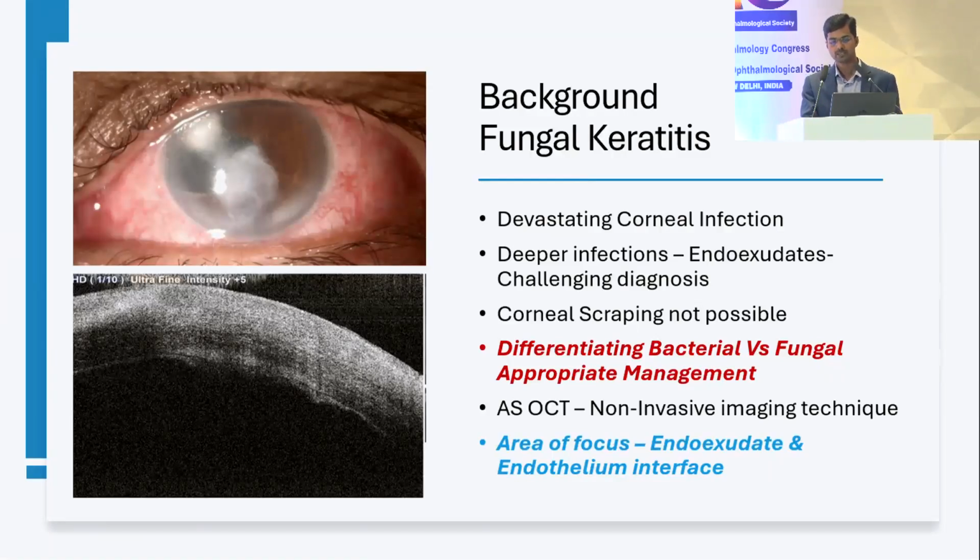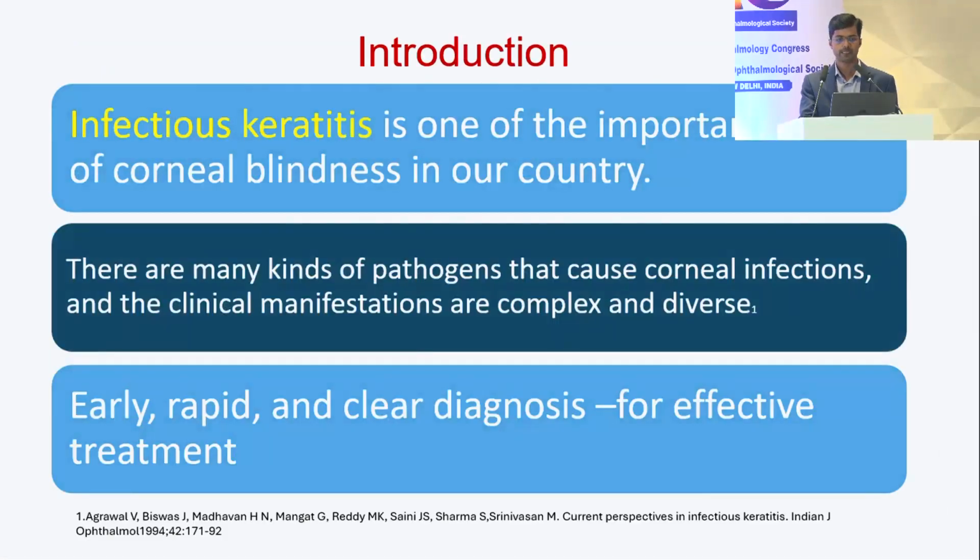So in these scenarios, anterior segment OCT is a very useful non-invasive imaging technique to diagnose fungal infections. The area of focus in anterior segment OCT is the interface between the endothelium and the endoexudate.